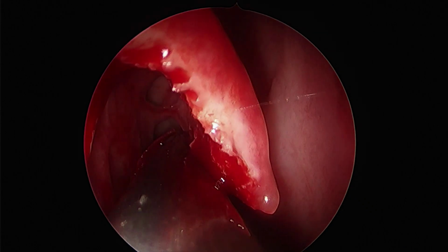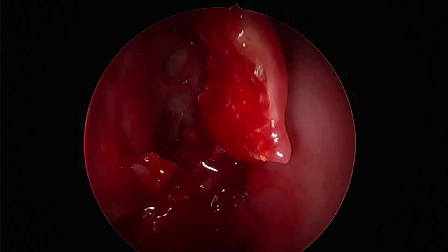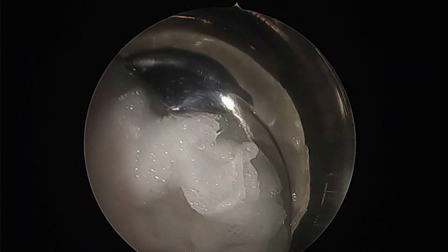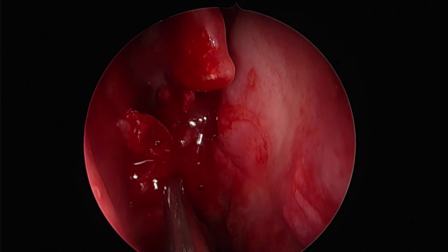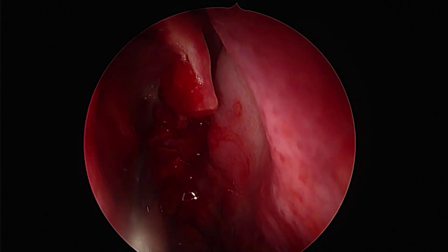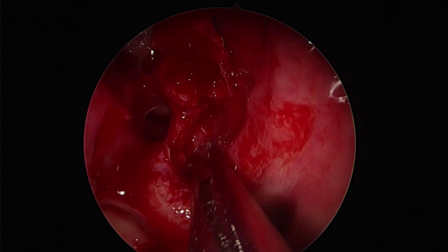What we can appreciate is the ethmoids are rather well dissected in the prior surgery, and though our CT showed us that there was opacification, all that seems to have gone post the steroid use. So if we can summarize the issues in this surgery, what has led to revision is basically just a severely hypertrophic and edematous middle turbinate and an Onodi cell.